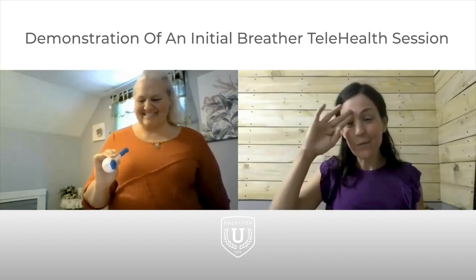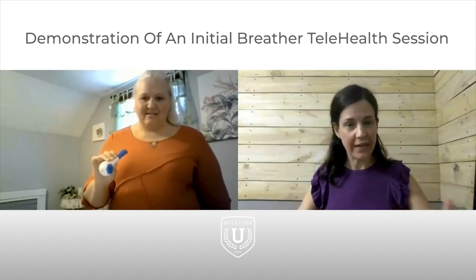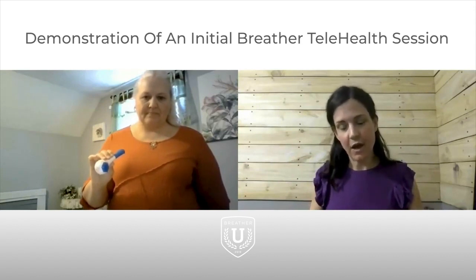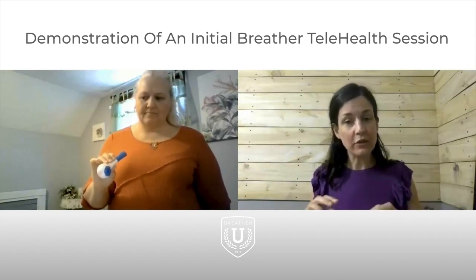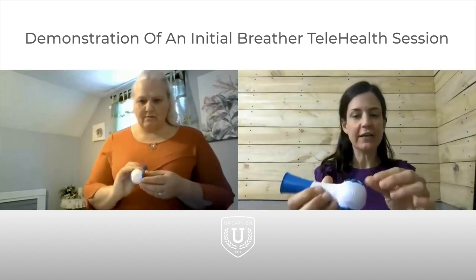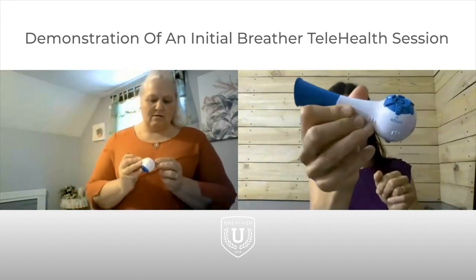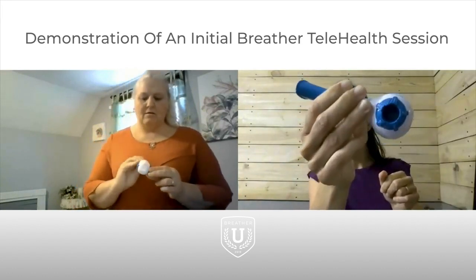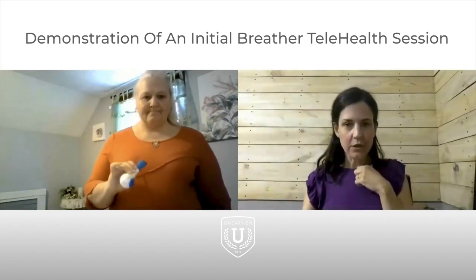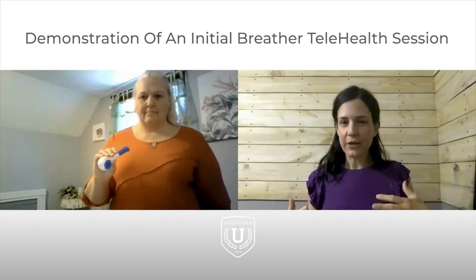Okay. With your diagnosis of COPD, I want to make sure you're pushing all the air out. It's important to get the air out so that we can get the oxygen back in. So I want you to leave exhale on 1, and let's go ahead and turn the dial for inhale. Turn that to 2. So it'll read inhale 2 and exhale 1. Okay. So let's give this a try. Did you have enough of a break? Are you out of breath at all?